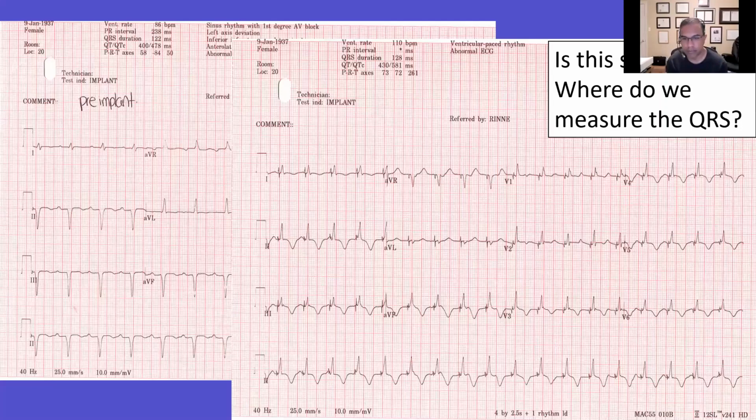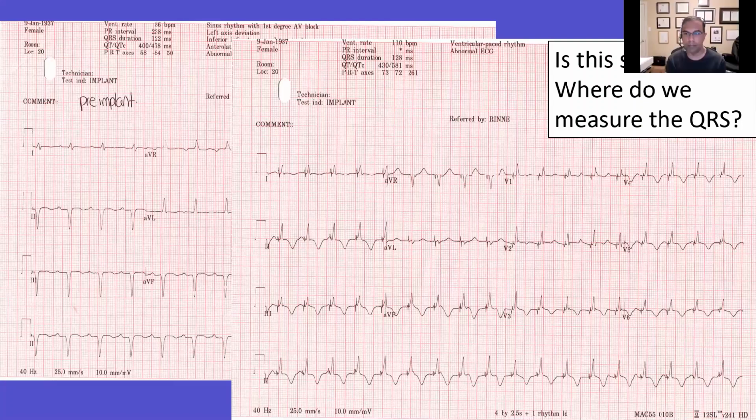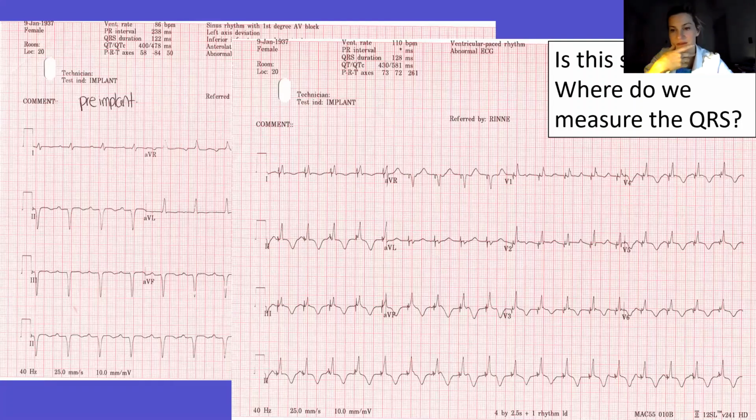Consistently, exactly. I think that's a really good point. I think maybe defining or documenting the latency, how much that is, and then the QRS itself might be very helpful for perspective.